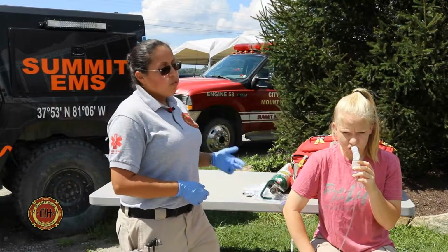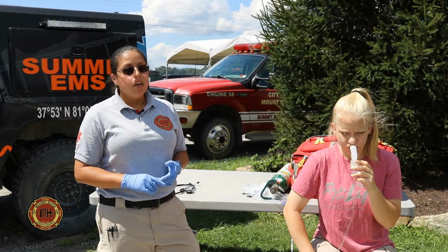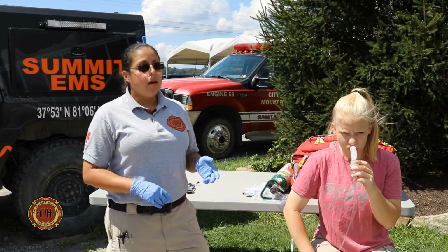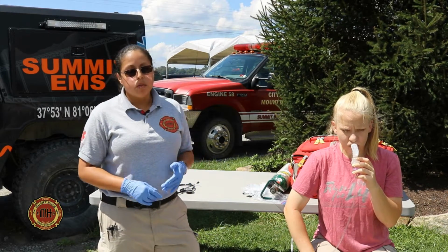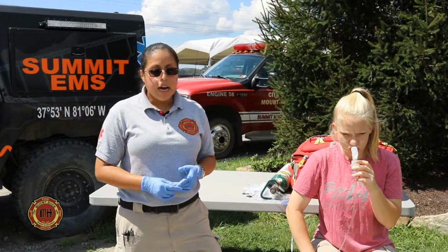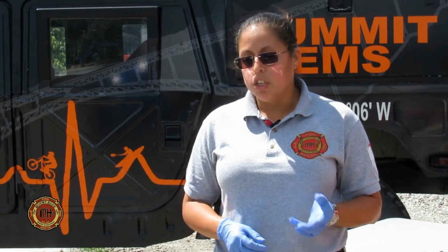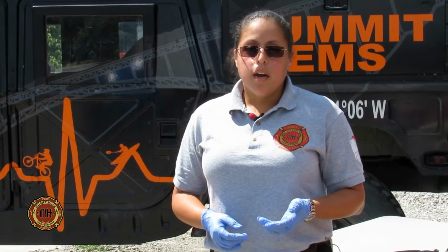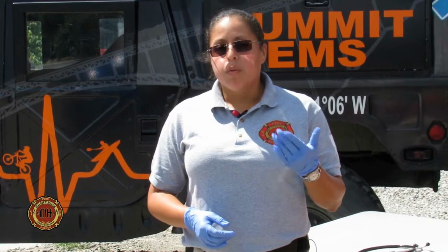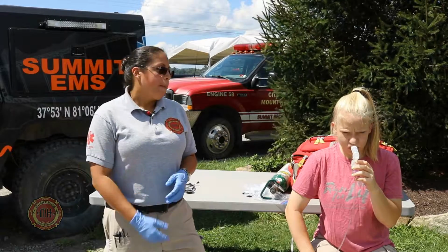If their heart rate is greater than 130, it's still going to be the same medication. You want to make sure that this heart rate is not being caused by something other than respiratory distress. You're going to continue to monitor your patient and their vitals. If they start having chest pain or any other cardiac symptoms, make sure you stop your treatment and use the appropriate protocol for whatever signs and symptoms they're exhibiting and contact MedCom for further. And that's it.